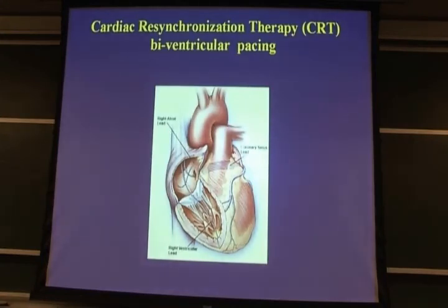The remedy is to put a catheter, or you put a pacing electrode right here, and you put another pacing electrode through the coronary sinus in the left ventricle. You try to put it where the left ventricle is very delayed. And if you pace it faster, then you bring it forward in time, and you hope you'll resume synchrony. So electrically, you're trying to resume synchrony.